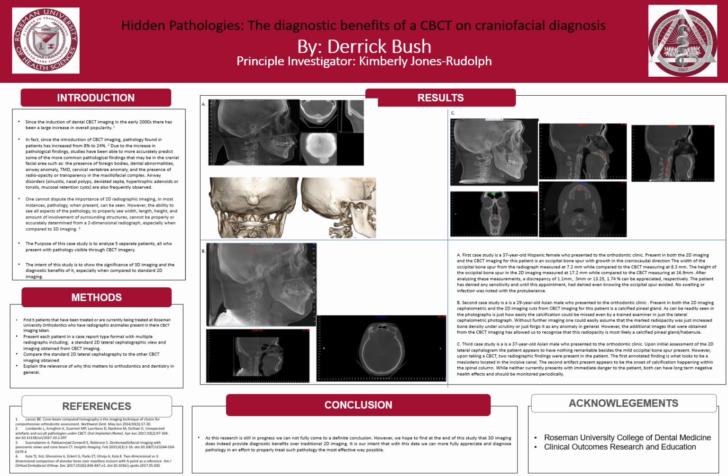So today, as we speak about CBCT imaging, we're really going to focus on the difference between CBCT imaging in contrast to standard two-dimensional imaging or standard X-rays. Since the induction of dental CBCT imaging in the early 2000s, there's been a large increase in overall popularity. And in fact, since the induction of CBCT imaging, pathology found in patients has increased from about 8% to 24%.